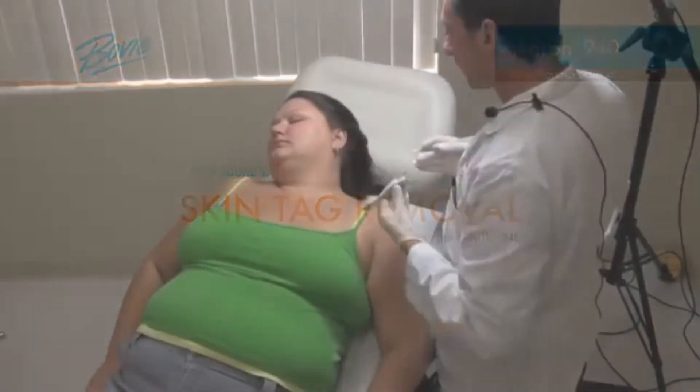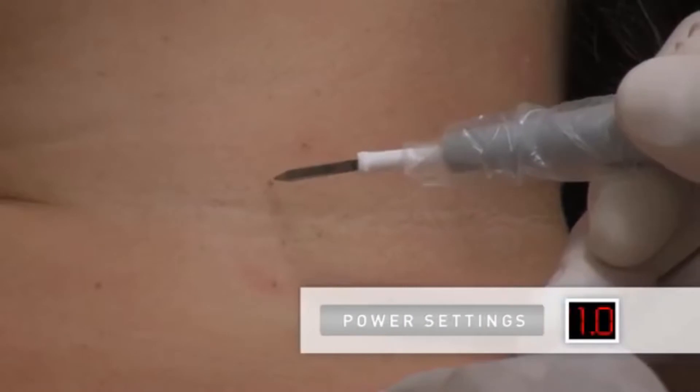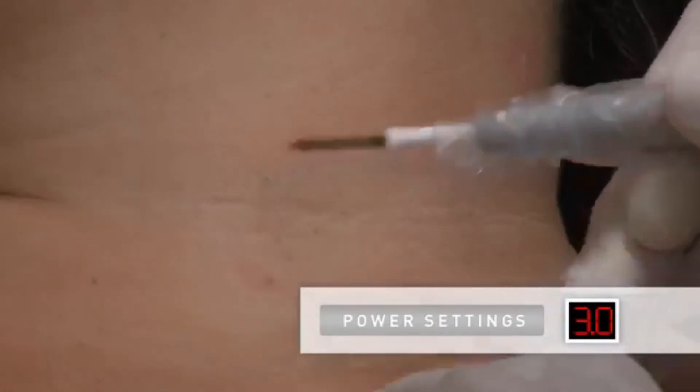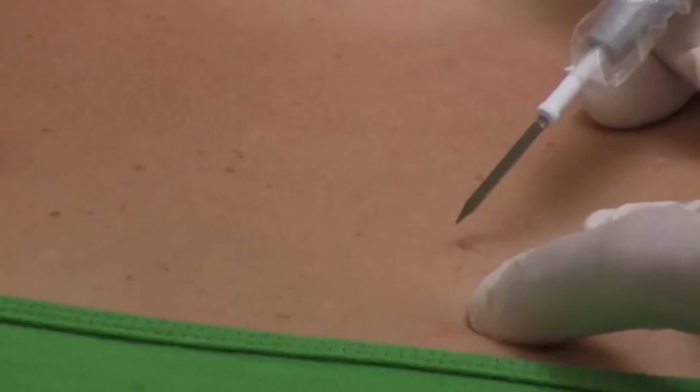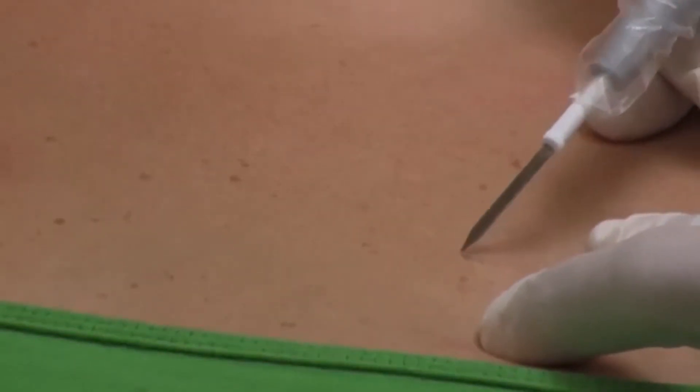To remove skin tags, we will electrodesiccate lightly at a power setting of 1 to 3 watts. A fraction of a second is all it takes, and then the tag will blanch and can be removed. It is also possible to leave the tag and it will fall off in a few days. Here are a few examples of skin tag removal.